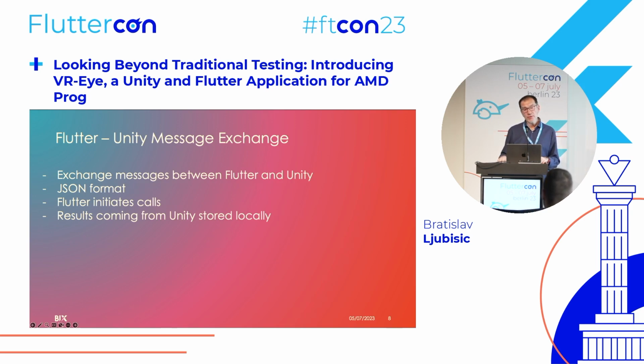Once the application is started and the patient selects the test, Unity will start with parameters coming from Flutter. Those parameters are almost always the language to be recognized within Unity, and other test-related parameters, such as the position of elements on the screen and that kind of stuff.